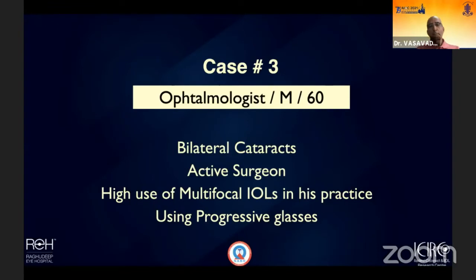This is a very important case, and I want to share it with our colleagues who are listening here. And the question asked is, what would you do? There was a survey done on more than 90 ophthalmologists in the US, and they asked, what lens would you prefer to have? Those surgeons who put in more than 50 multifocal IOLs selected multifocal in 40% of cases, but the rest, those who never put in multifocals or fewer than 50, went for quality. In other words, they went for monofocal IOLs.